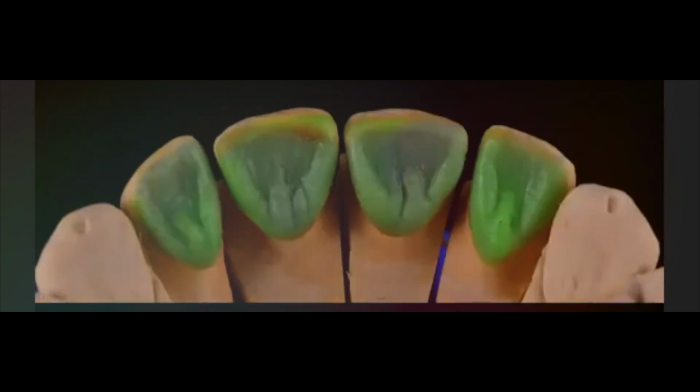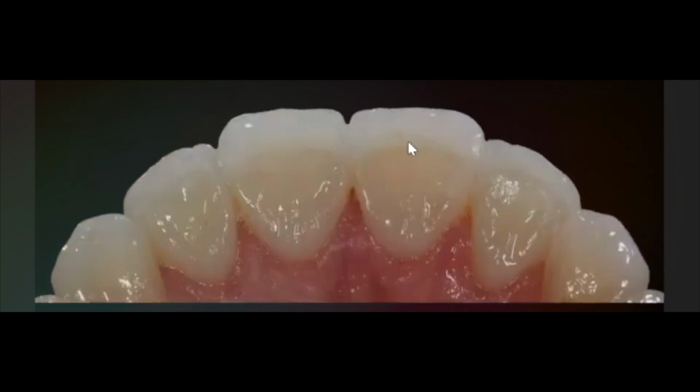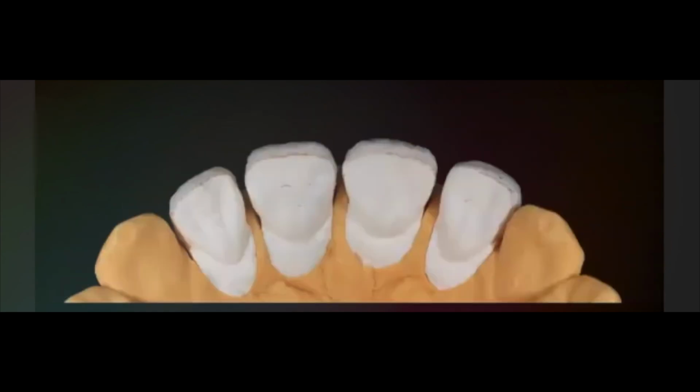So first of all, we decided to make monolithic palatal veneers, only palatally, in order to restore, first of all, the palatal surface. We press them and then we cement them. So we finished with the palatal surface. Then new preparations for the facial surface and a new impression, and then we proceeded to make 4 feldspathic veneers on refractories.